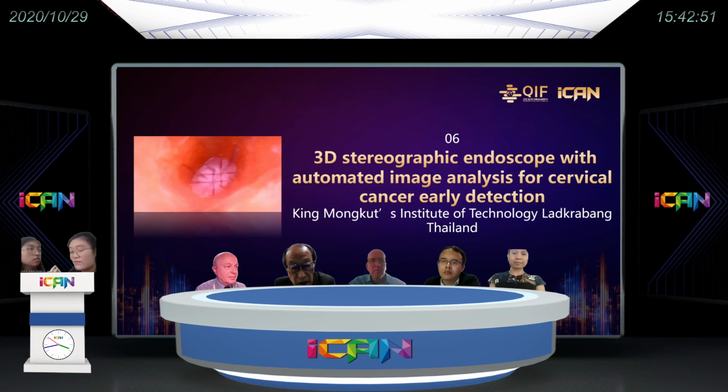The size of the colposcope that we made is around 1.5 centimeters in diameter. So is your endoscope smaller or bigger than the normal endoscope?